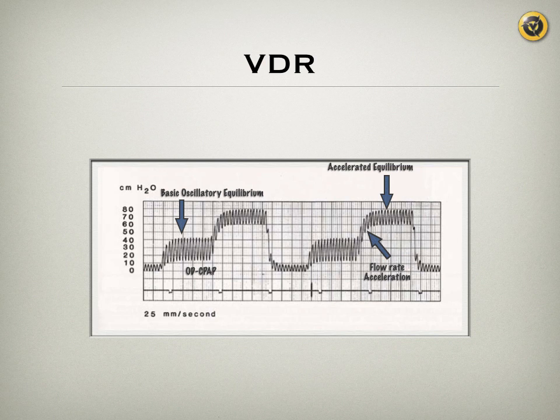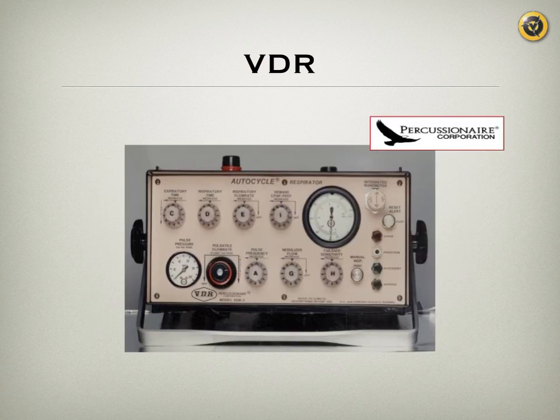This is just a picture of the ventilator. It's a pure pneumatic ventilator. It does not have any electronics in it, so all you need is a pressurized gas source, and you can use it anywhere. And the problem, because there are no electronics, is that adjusting the knobs to get to the frequency, the convective rise, the rates, and so forth, is going to be interactive. So when you change one knob, you might have to go back and adjust other knobs to get to the same character. So learning it is not that difficult.